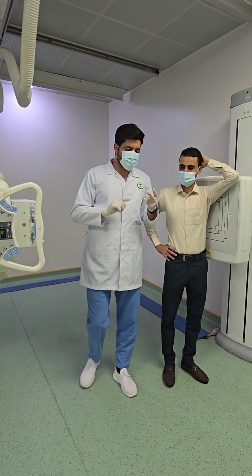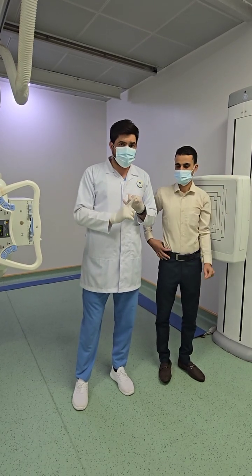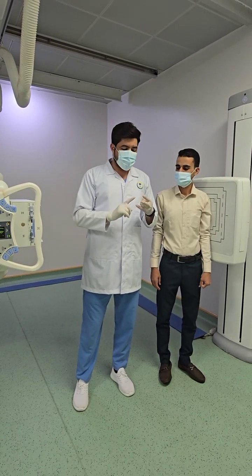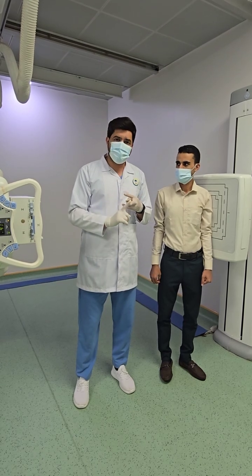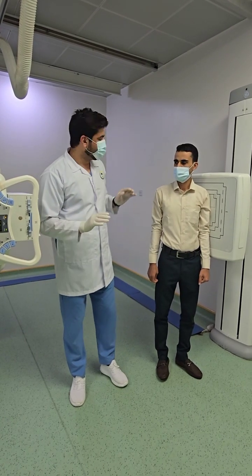We covered two views. One is posterior, other is anterior. In the anterior we covered right anterior oblique and left anterior oblique, and in the posterior we covered right posterior oblique and left posterior oblique. Now the remaining one is the lateral.